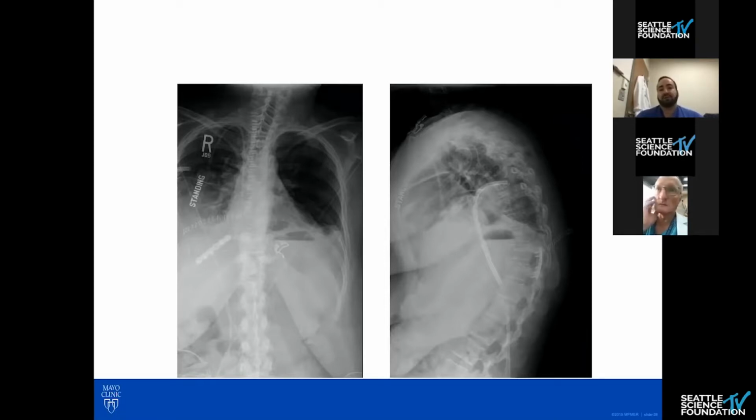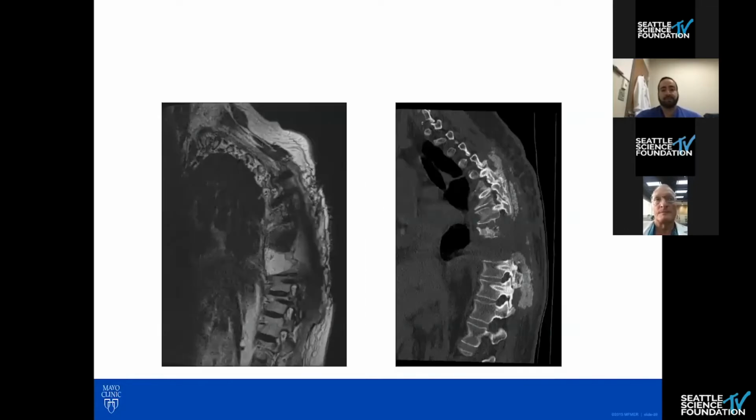And therefore, not only does the carbon fiber instrumentation allow for her to get proton beam radiotherapy, but it allows for a better and more crisp way to image her to be able to see if she does have local recurrence. Luckily, she does not have any distant lesions, just a local recurrence that she's had. And you can see a lot of the fresh bone graft on the CT on the right. You can see the imaging is much more crisp through this area. This is her immediate post-op radiation planning simulation images.